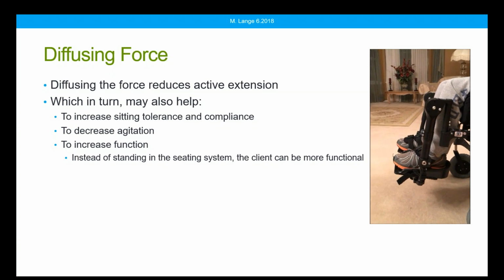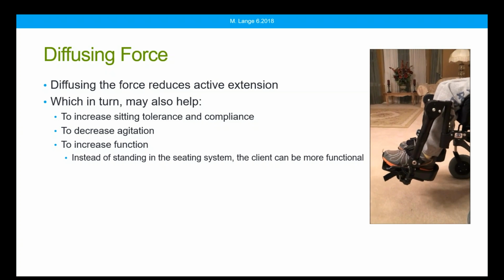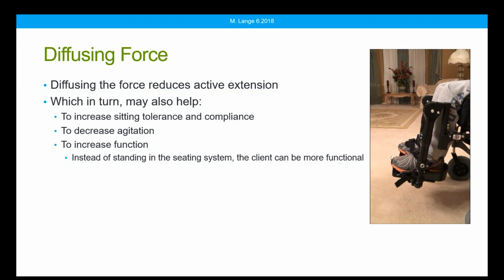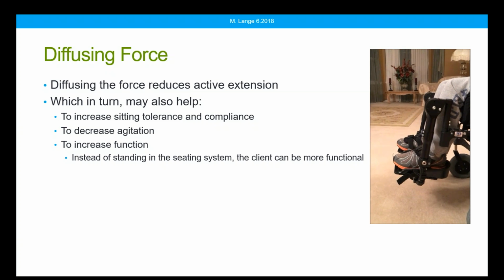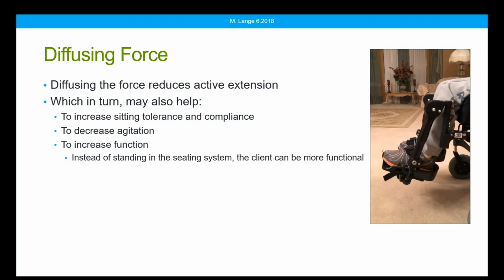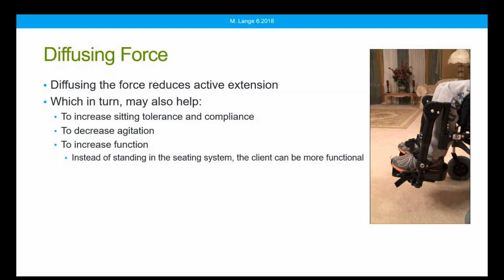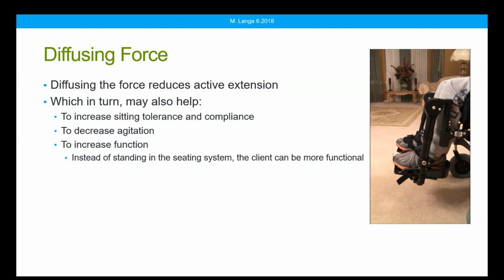So this has worked out very well. And compared to the Kid Rock for Spencer, what's been really nice about these dynamic footrests here is that they're separate. The Kid Rock, if you're familiar with it, was one single footboard. So if the client moved on just one side of their body, sometimes that footboard didn't always move very readily. These move individually. So if the client extends with more force on one side of their body, which you can see Spencer here often does, one or both foot plates can move together.